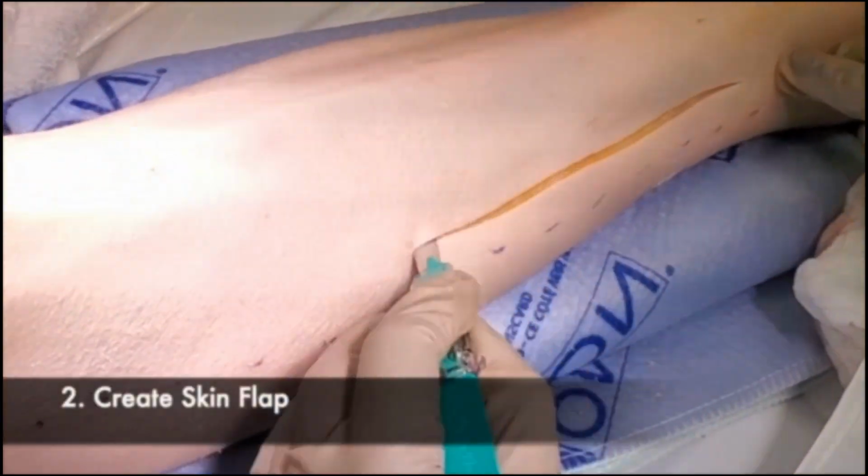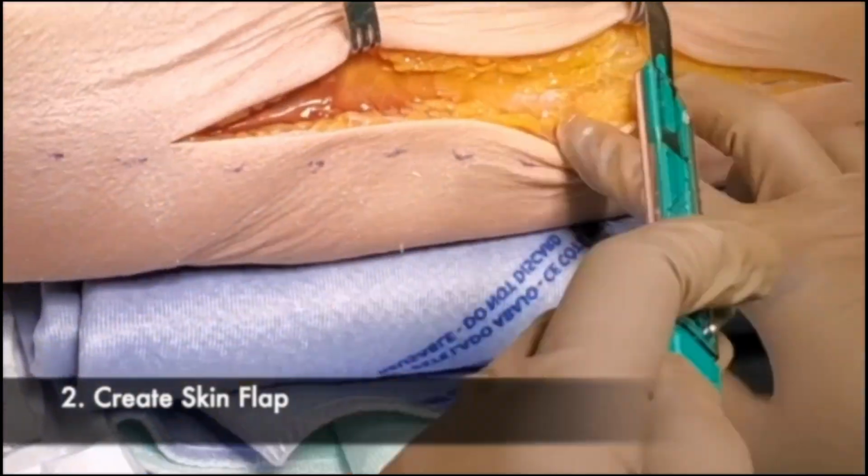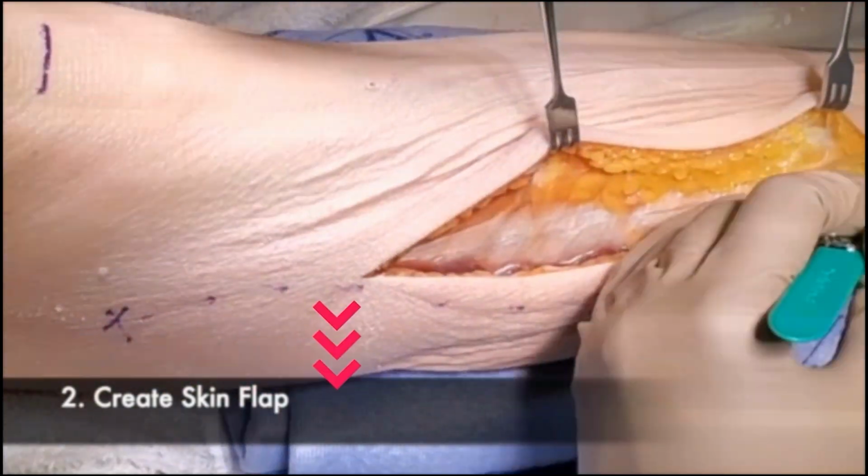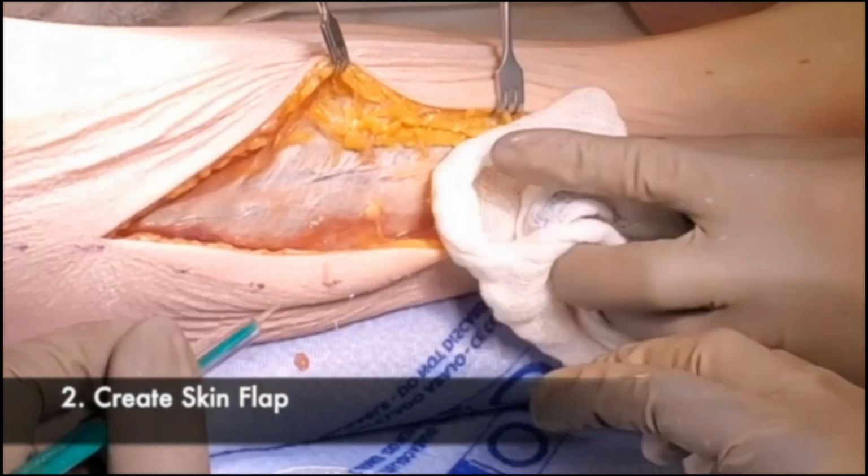Next, create the skin flap. Make one long incision through the punctuated line. A common mistake is to make the incision too posterior, missing the anterior compartment entirely, so make sure your incision is 1 finger anterior to the line of the fibula.